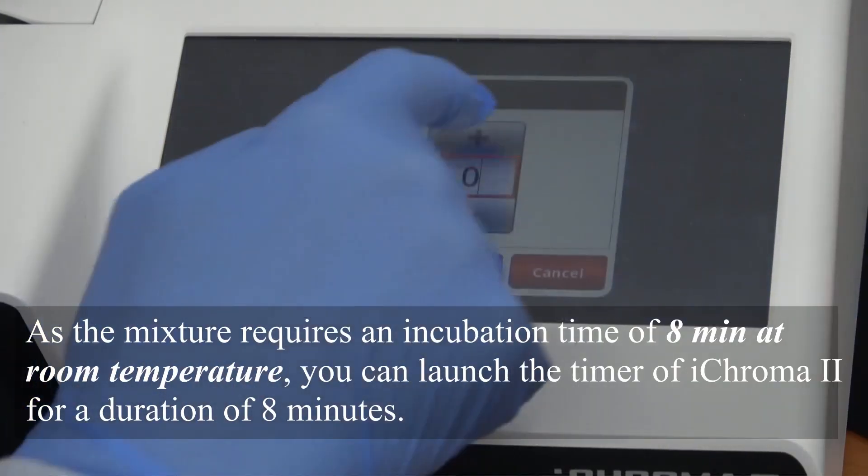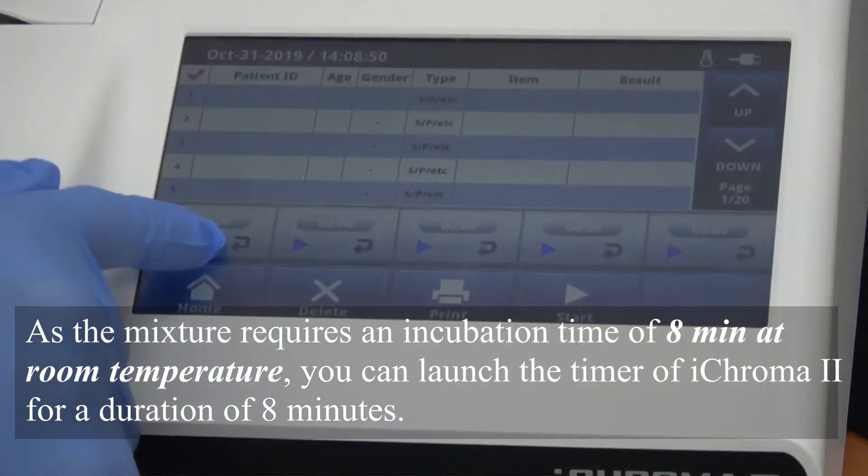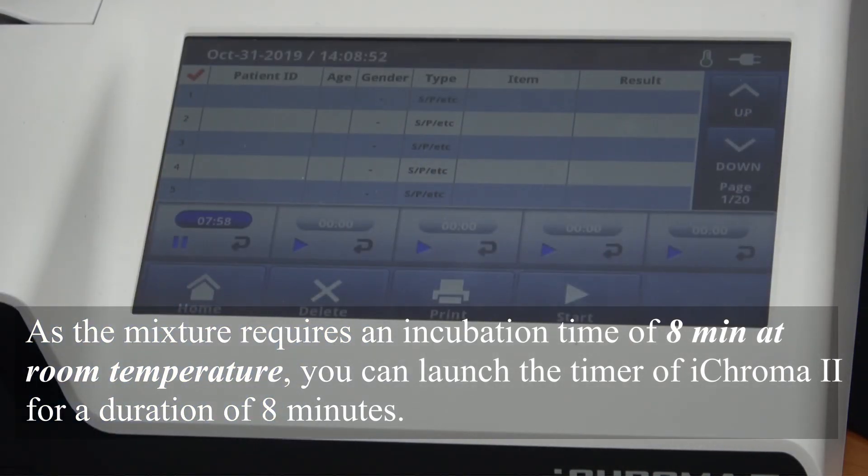As the mixture requires an incubation time of 8 minutes at room temperature, you can launch the timer of iChroma 2 for a duration of 8 minutes.